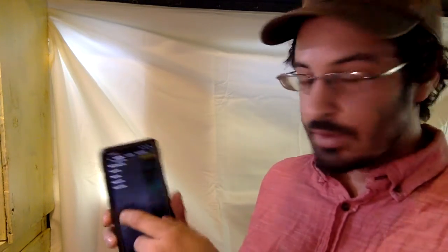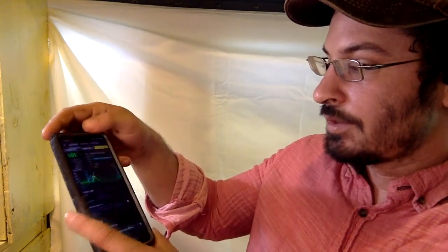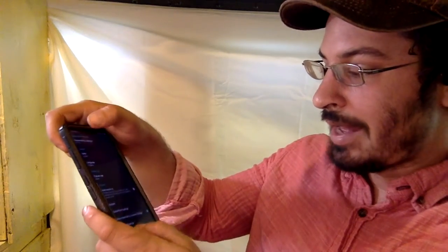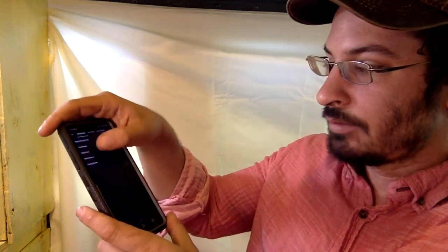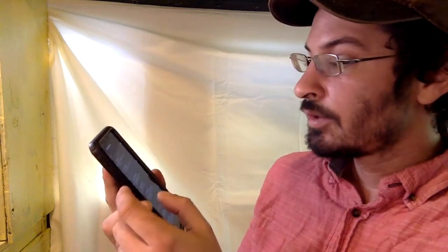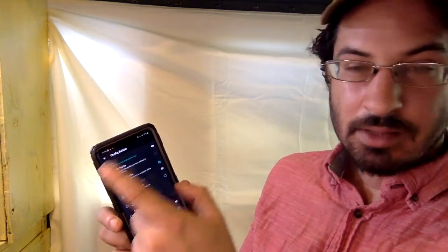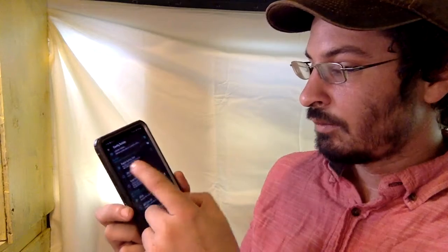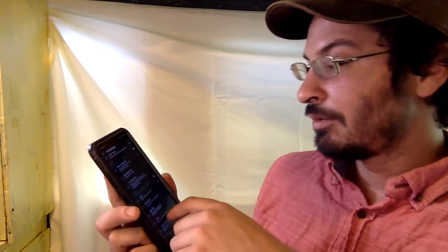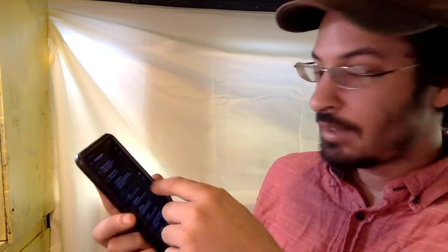So you have two major settings areas. You have preferences over here, which is more like technical stuff with the app, and then you have the configuration builder here. So local profile just means I'm getting data not from Nightscout. Rapid acting, ultra rapid, free peak, this is the type of insulin you're using. So I have it set for FIASP.